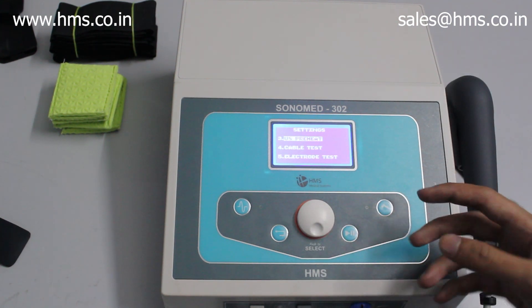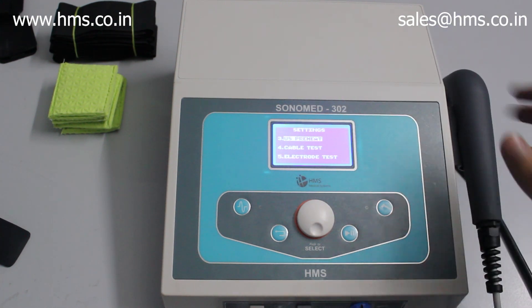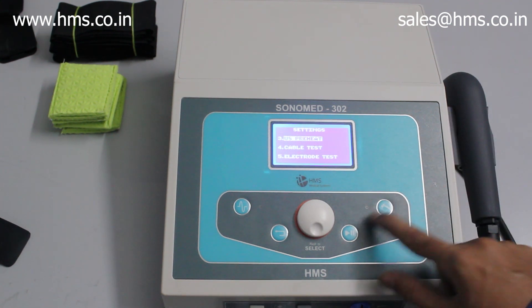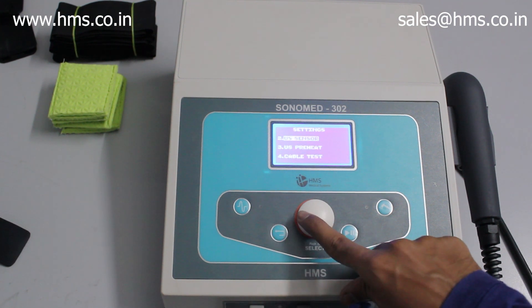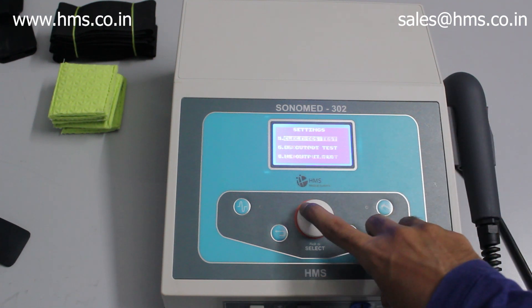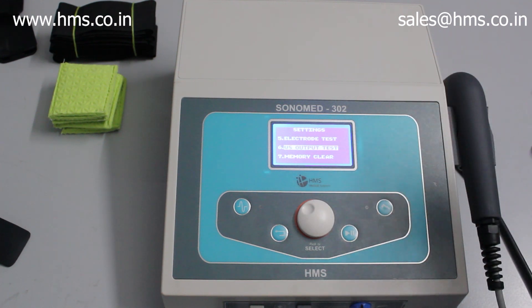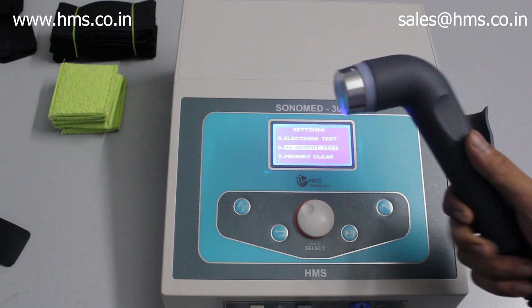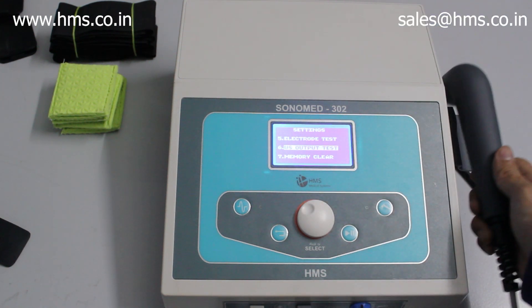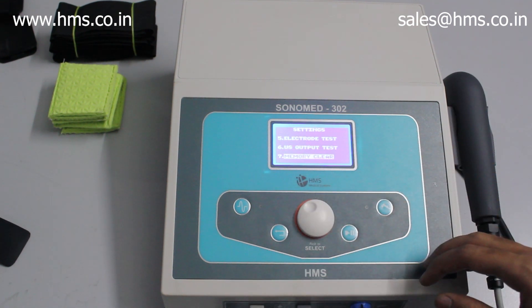There is also a transducer preheat feature, which is useful if you live in a very cold place — you can preheat the transducer before giving treatment. Next is the cable test, which tests the conductivity of the cable, and the electrode test. There is also an ultrasound output test that verifies the transducer is working properly. Finally, the memory clear option clears all saved memories.